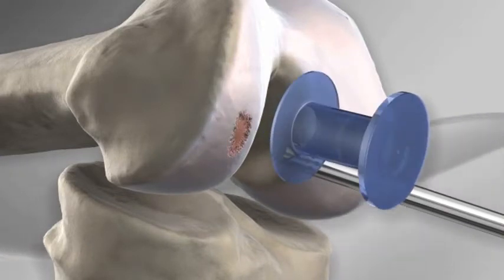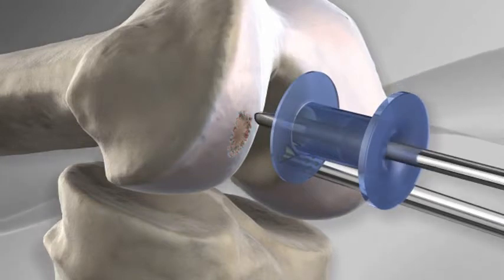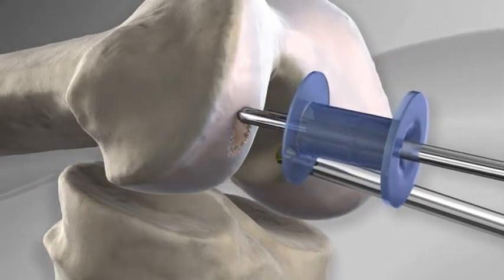The articular cartilage injury in the knee is identified and probed. An arthroscopic shaver or burr is placed inside the knee through the cannula.